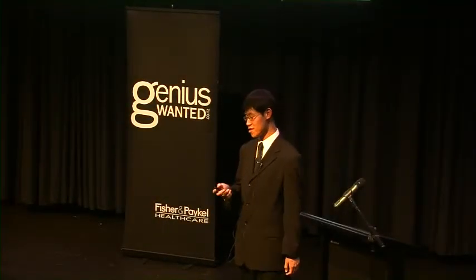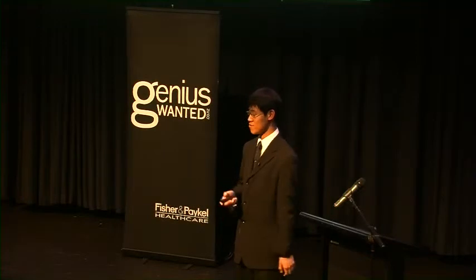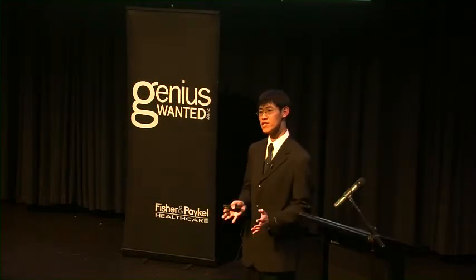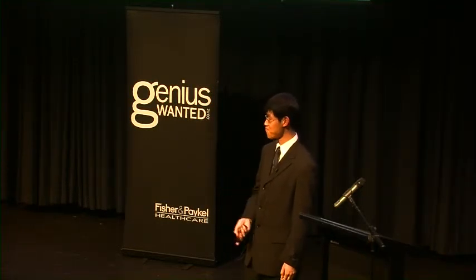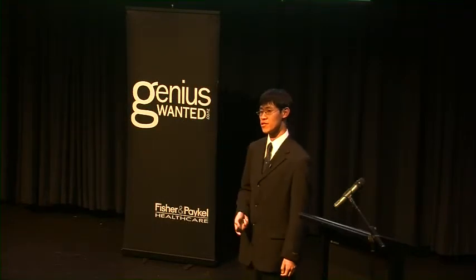The idea is that instead of putting a patient inside the scanner, we put something called a phantom. And a phantom is a substitute for a human being. For example, this orange ball that I have made for my master's project. Now this phantom here is stationary. That means that there are no moving parts inside the phantom. So that means any non-zero velocities that we register in our phase contrast images must be purely due to background phase. The scan sequence that I used is a special eddy current scan sequence.